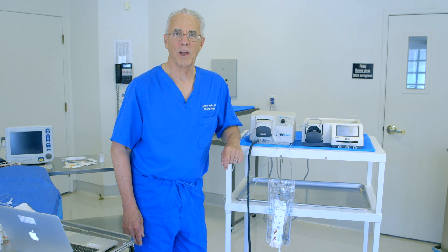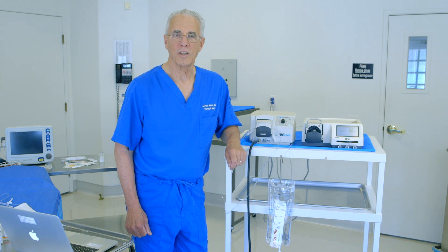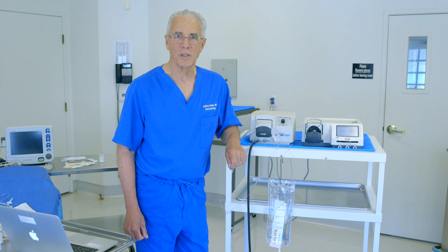Hello, I'm Dr. Jeffrey Klein, inventor of tumescent local anesthesia. In this video, I'm going to discuss the devices that are used for efficient tumescent infiltration of local anesthesia.